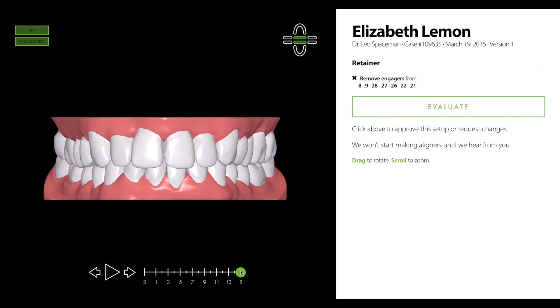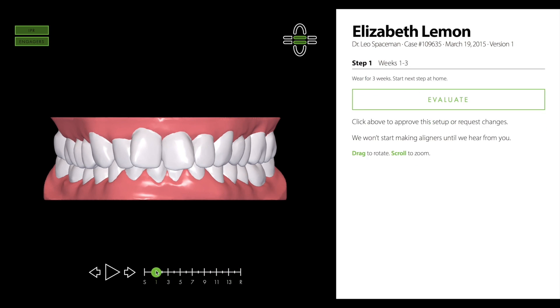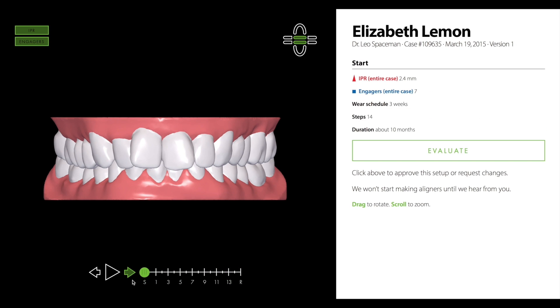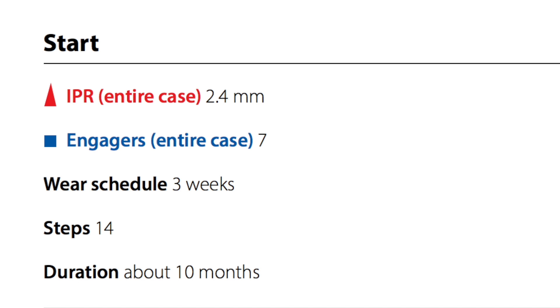Drag the timeline all the way to the left to view a summary of the entire case, including an estimate of how long treatment will take.